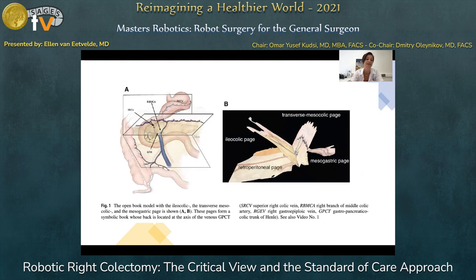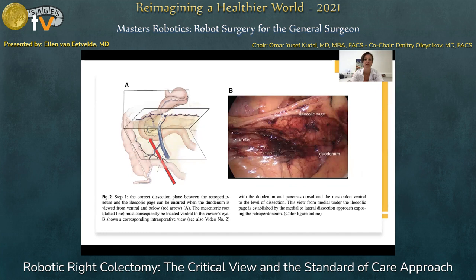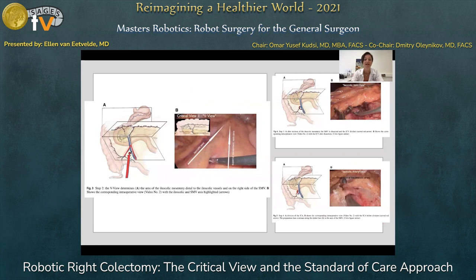The first dissection is the sub-ileal dissection where we separate the ileocolic page from the retroperitoneal page, and we dissect over the duodenum and the pancreatic head. The second step is the V-view, where we identify the ileocolic vessels and superior mesenteric vein, and we start dissection in the avascular space between both structures.